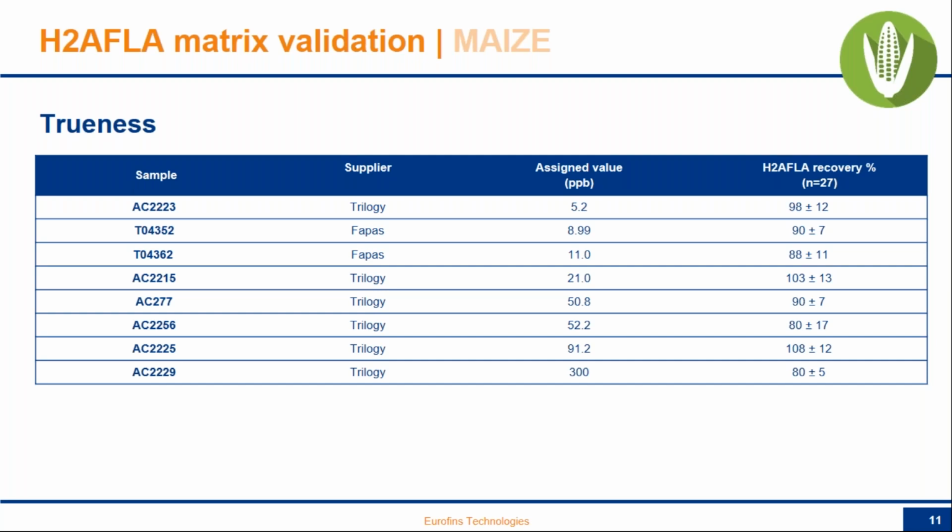Each sample was extracted 3 times and run in 3 replicates on 3 different kit batches, as we had them available. So moving away from the top of the curve, where you remember we had a little overestimation, you see that the matrix effect disappears as it normally happens with immunoassay, and results are accurate and pretty compact without significant trends or drift related to the sample concentration.